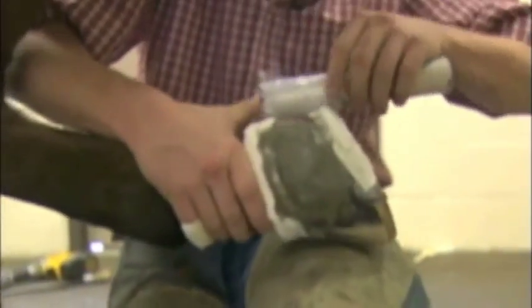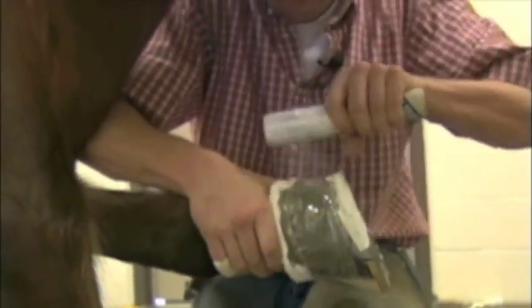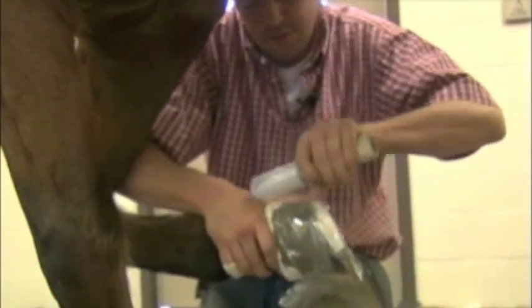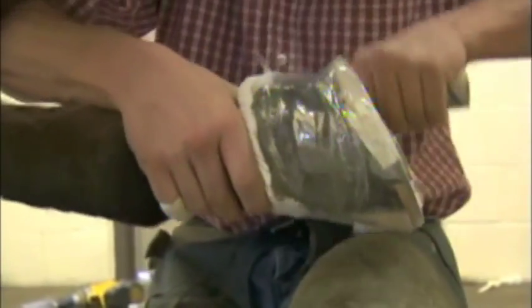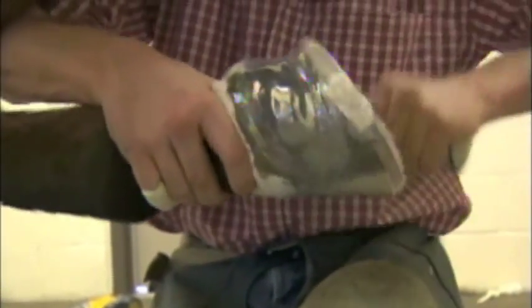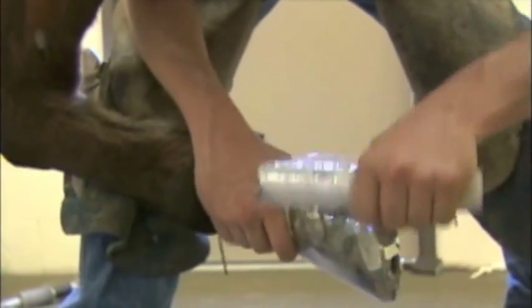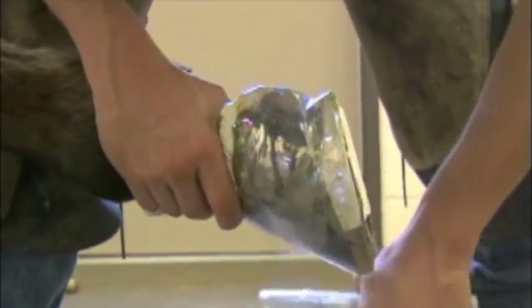Once the glue starts getting tacky, we'll go ahead and wrap it with the plastic wrap, just pressing the glue nice and tight into the fabric. You want to be careful when wrapping with the plastic — you don't want to shift the patch. You want to keep it in the same spot, so pull it pretty tight over the heel bulbs and just lay it over the patch.